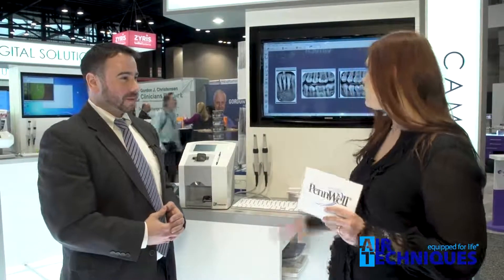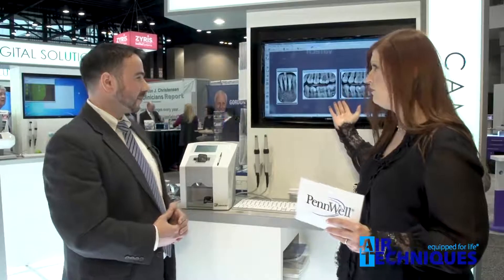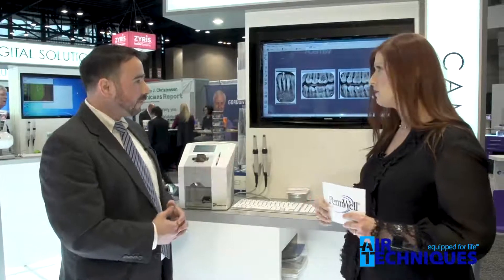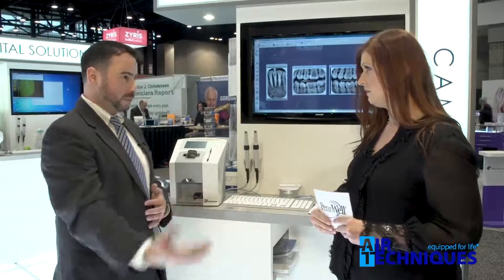I definitely like protection and backups with any type of digital information. I have to say, we really can't say anything negative about the image quality — these are not my teeth, by the way — but the image quality is superb. The filters available with our interface really make the images jump out at you, so it's really ideal for any practice, be it pedo, or anybody dealing with geriatric, or your general GP.